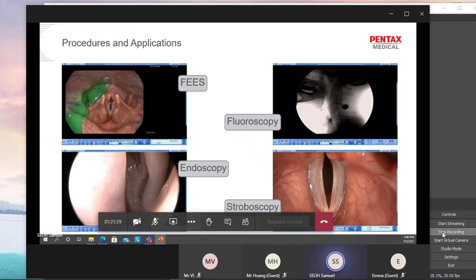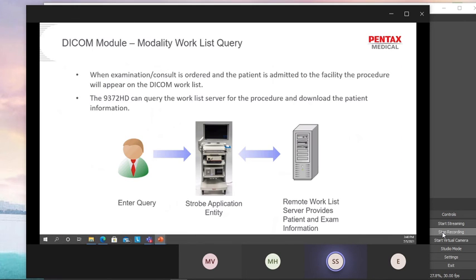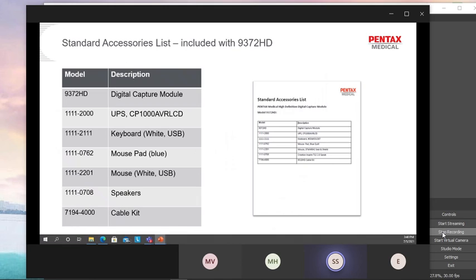Configuration is fine. Yeah. No DICOM. Yeah, you say you don't need DICOM, so I don't push.